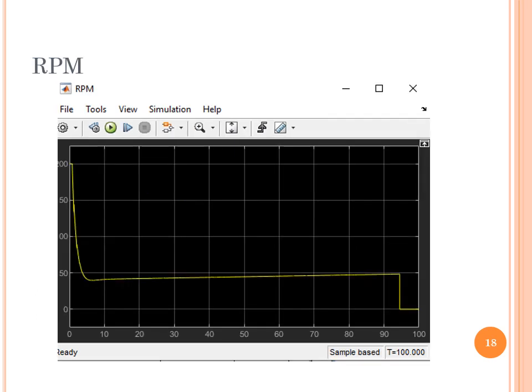This figure shows the speed of the motor in rounds per minute. Note that this is the output of the flow PID controller. The spike at the beginning is the result of the system trying to reach the desired flow in the quickest time. Also note that the RPM increases slightly with time. This is to overcome the increasing pressure at the outlet, which is due to the increase of fluid volume in the model bladder.